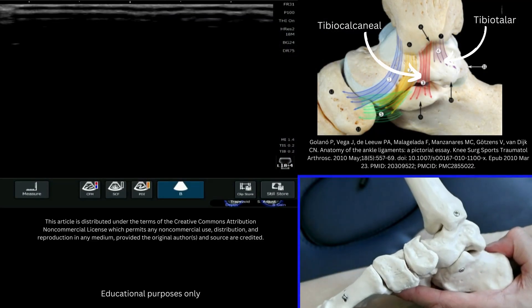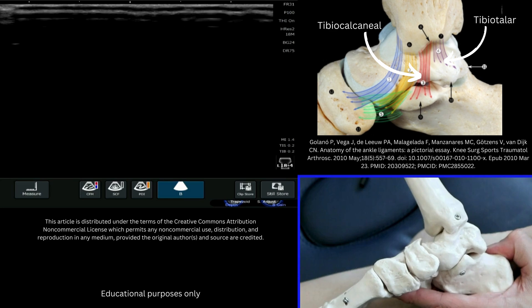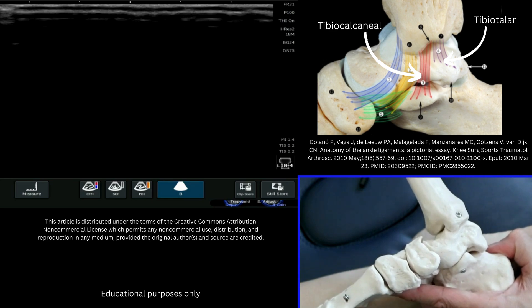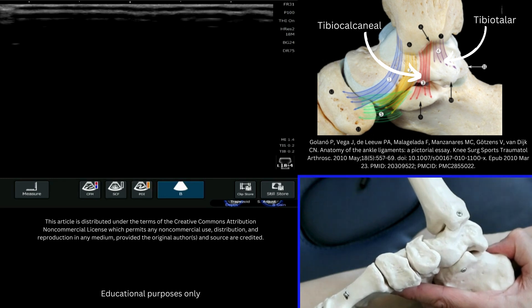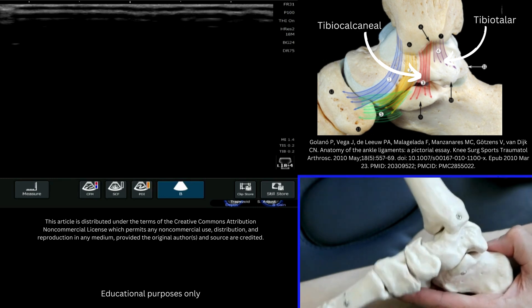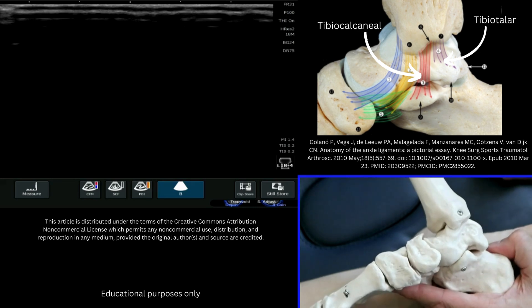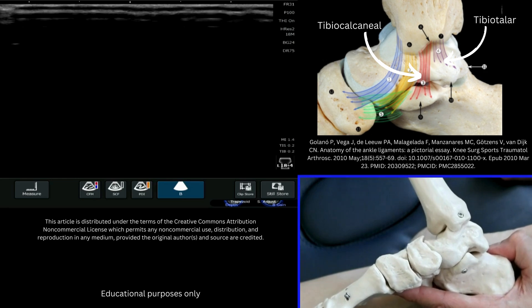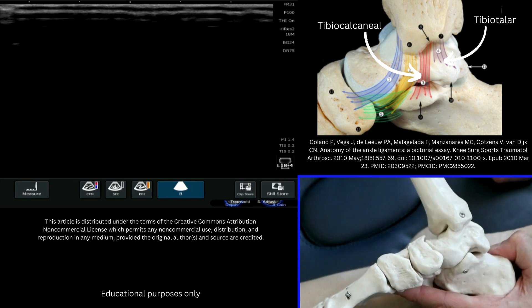We're now going to have a look at the deltoid ligament complex and in particular two aspects of that ligament complex. When we look at this region it's important to understand the skeletal anatomy, and that will give you a framework to work from in terms of looking for these ligament structures.